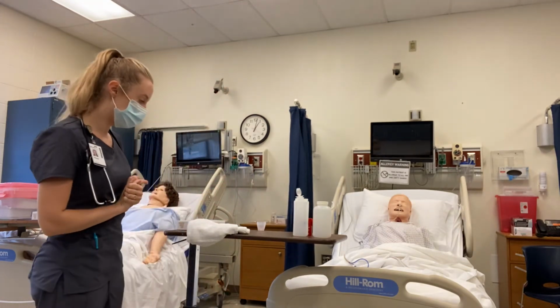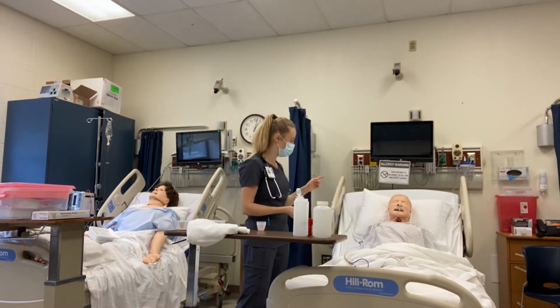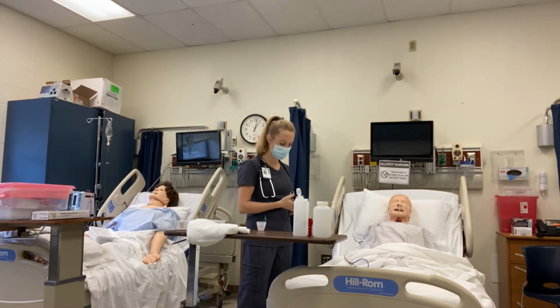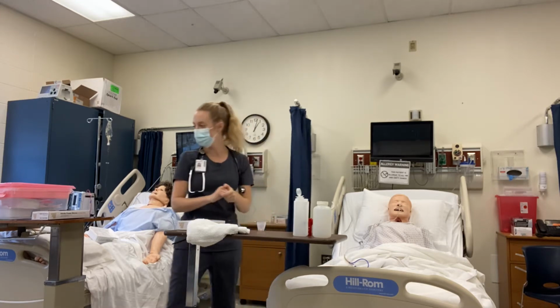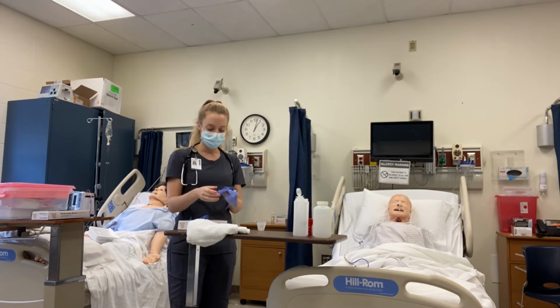Mr. Jones, my name is Grace. I'm going to be your nurse today. I'm going to be giving you a medication through your NG tube, the tube in your nose, okay? I'm going to be performing hand hygiene and donning gloves.